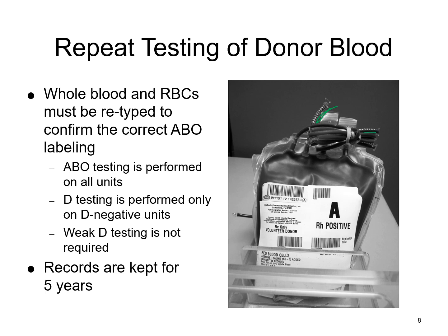It's usually a series of letters and numbers that are unique to each individual bag or collection set. So there are additional bags. Remember, it goes through that process of your whole blood, and then you spin it down and get your plasma products off of it, and you add your Adsol or whatever additive to this red cell unit. This particular one, I think it says Adsol down there.